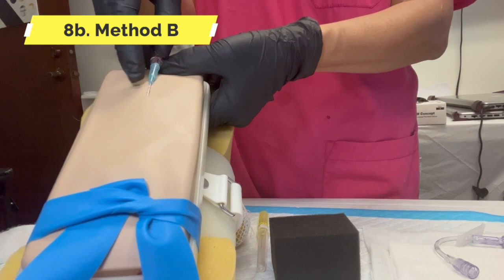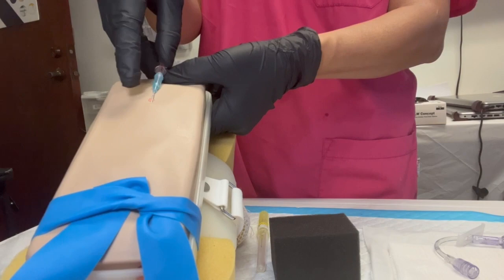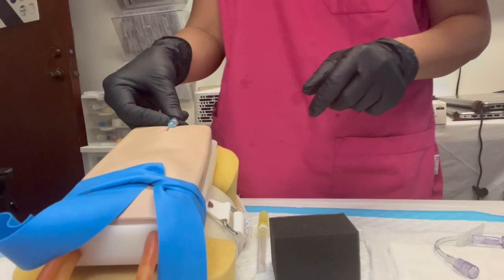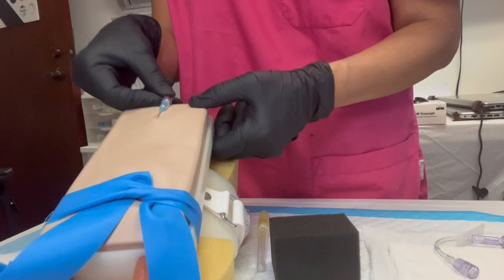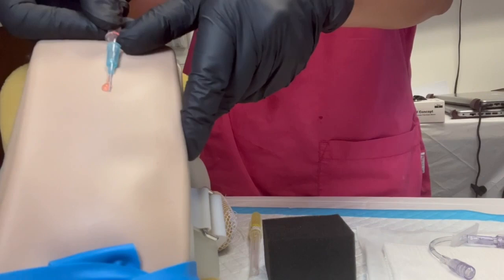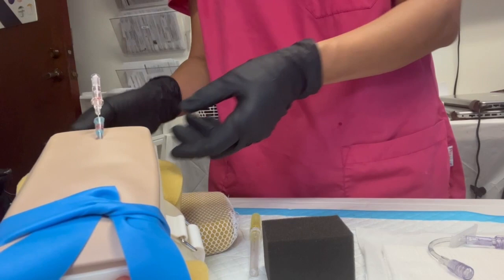Method B is when you're having trouble with method A. What do you do? Watch — use the nail of your thumb on the glove. Hold on to the clear because the clear does not go anywhere — not forward, not backward. Nail of your thumb, then push the hub. There should be a ridge in the hub. Hold on to the clear and gently thread it off — slide it off. It should look like this with a lovely needle neck.